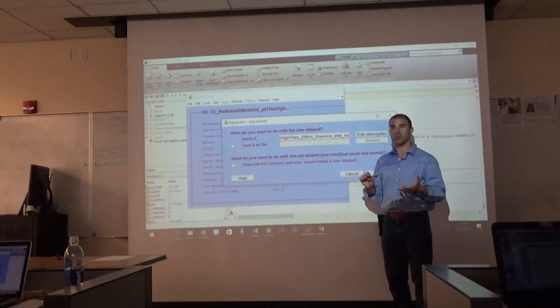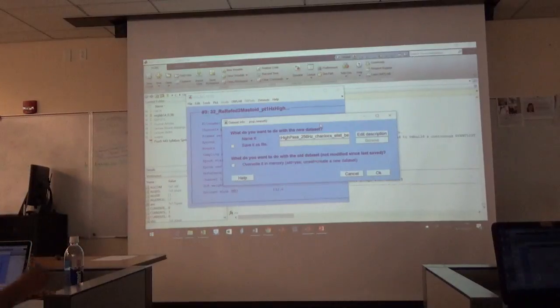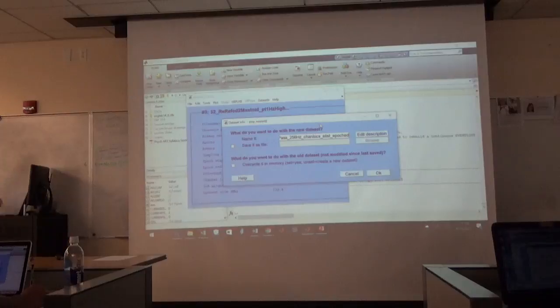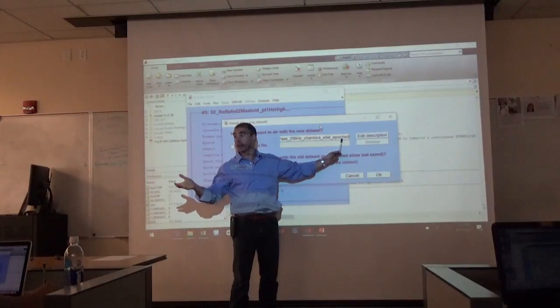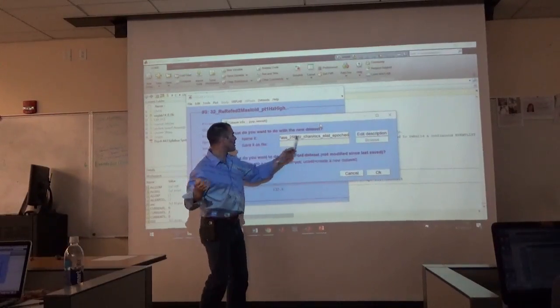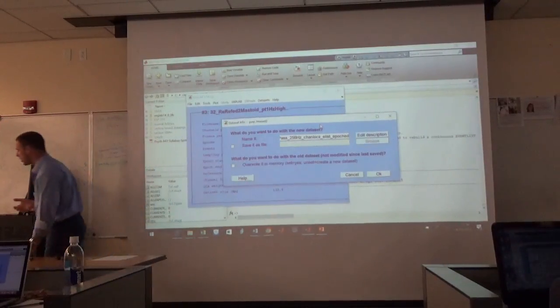Would that help you guys to know? Epoched, E-P-O-C-H-E-D. That way, when you have to come back and look at that file next time, you'll have a better idea of what you did. Does that make sense? Pretty easy. So just do that, and we want to highlight that again, and you want to check this box to save it as a file with the same name.